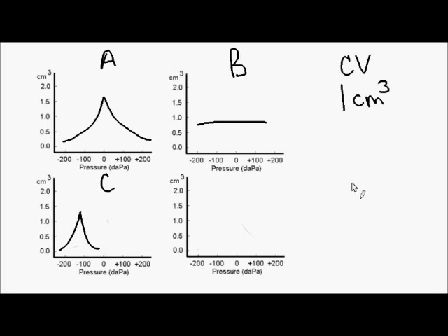The last two types of tympanograms are AS and AD. These are more rare, but still important. They are both variations of a normal type A tympanogram. AS looks like this. You can remember this by thinking of the S as shallow. The eardrum moves, but not as much as it should, which suggests fixation of the ossicular chain or otosclerosis.